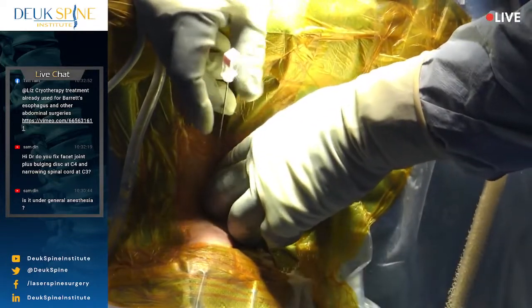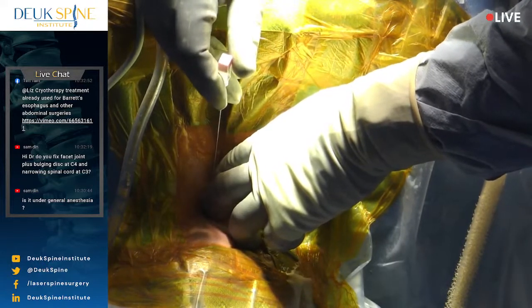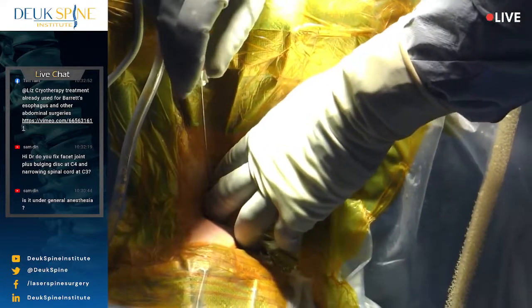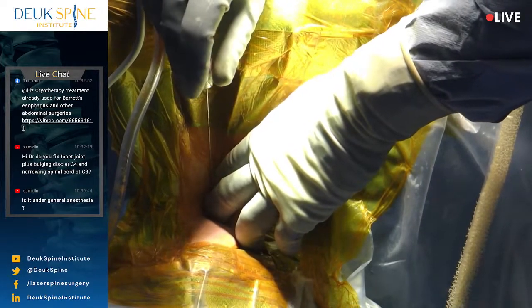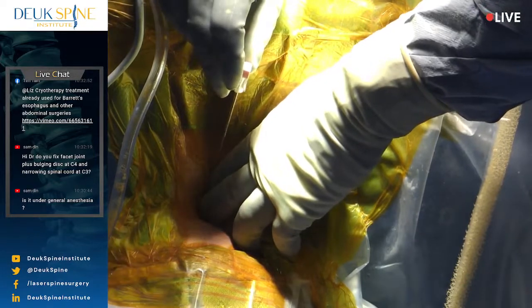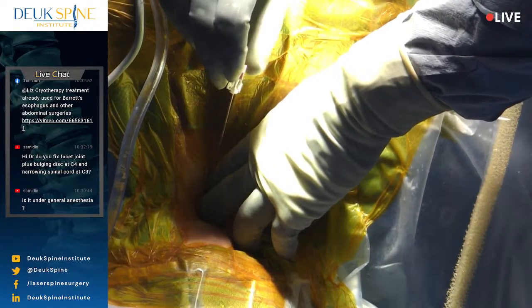How many, you have one needle on the field or more? I have another one. That's all right, we're good. Fire away. All right, so we're there. I just need to see if we're in the midline. Let's get a shot and then get another one.